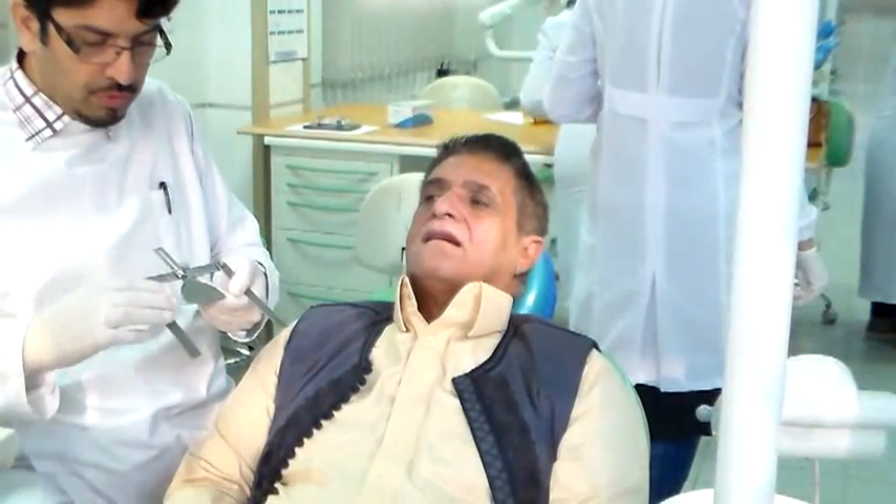Keep it there and we will start to adjust our occlusal plane. Now for adjusting the occlusal plane we need to use an instrument called the Fox plane — not the fishbow Fox, the Fox plane.